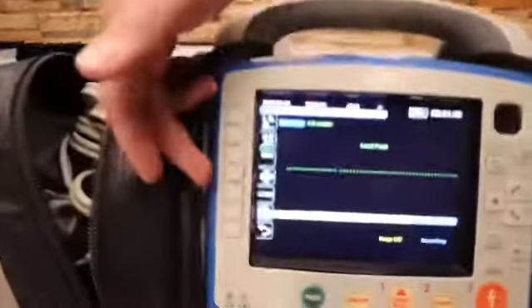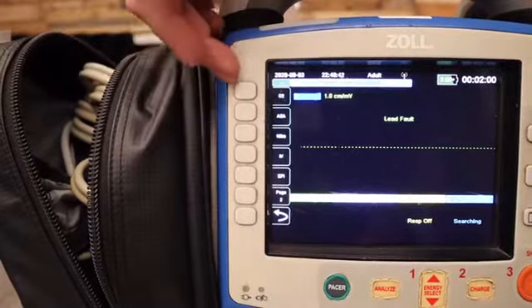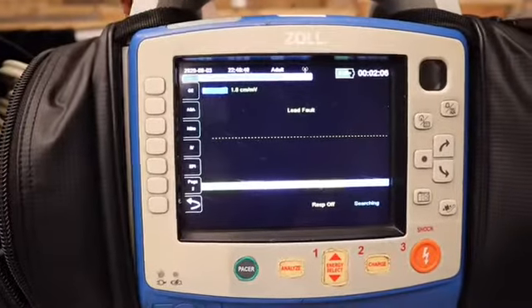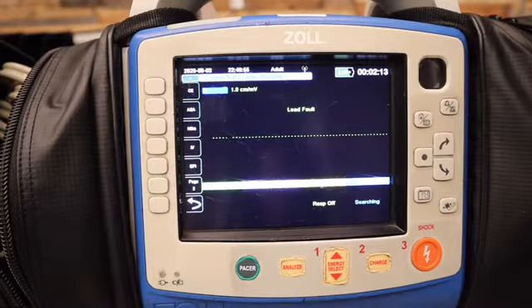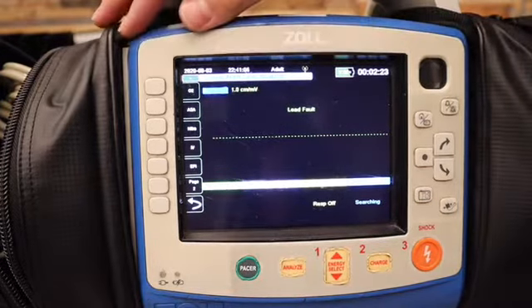Moving down the list, Rx — if we go into this, we have specific to our department different medications that we are allowed to use and that we carry. This allows us to timestamp when we use a medication. When we print off a treatment summary, that's going to show exactly when we administered that medication, as long as we are timestamping it when we give it.